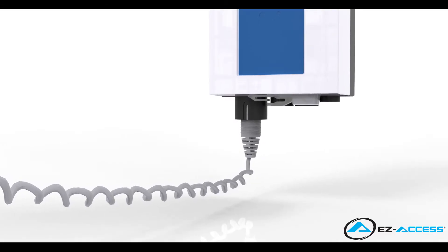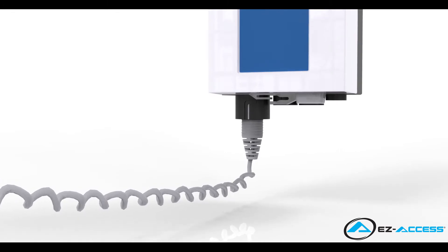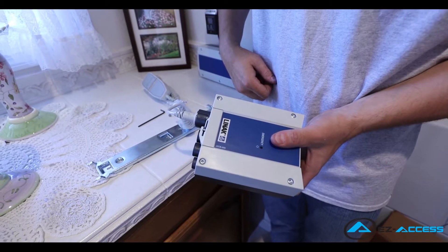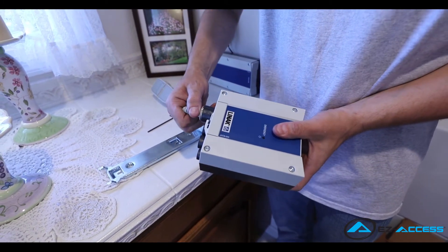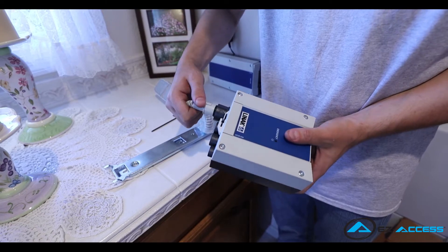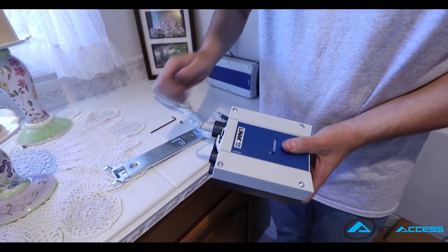The handheld control arrives already plugged into the control box, so no further assembly is required. If you do need to unplug it at any point and then reconnect, simply insert the plug on the handheld control by aligning its guide with the groove on the control box.